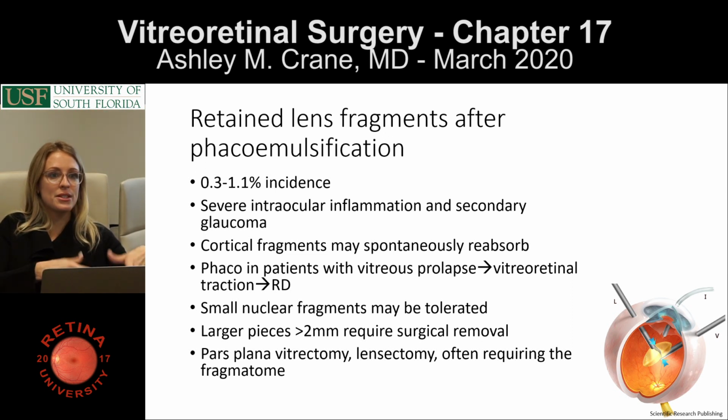But if this has been in the eye for 14 days and they've been on no steroids and the cornea is terrible, sometimes you can't see and you have to do what the situation allows. You made two good points worth reiterating. One is that it's important in cataract surgery not to dive down and try to save yourself, so let it go. Concentrate on getting the vitreous out of the anterior segment and put the lens implant in.